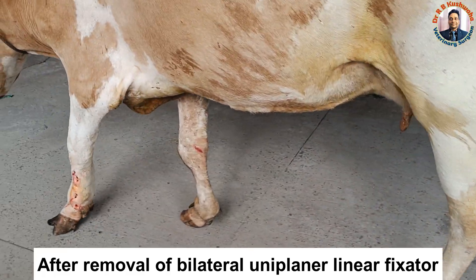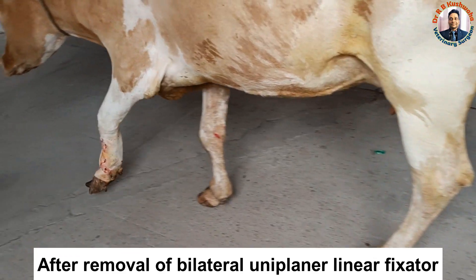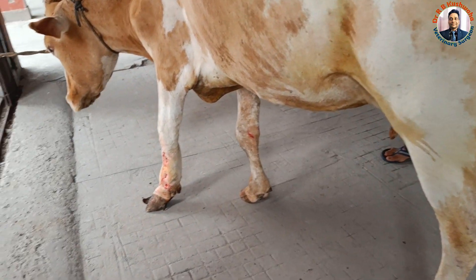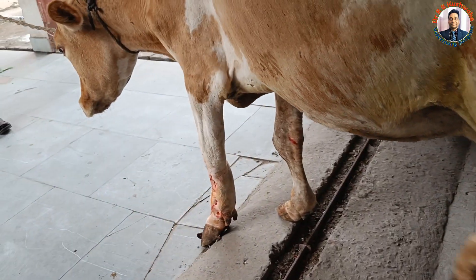Now you can see how comfortably the animal is walking after removal. The only concern is a large callus formation, which occurred because of the presence of the pin in the bone for a prolonged period of time.